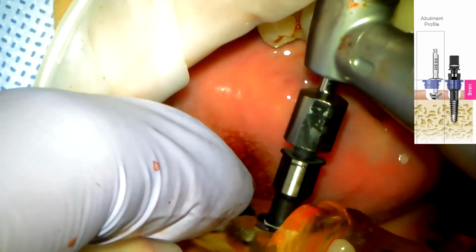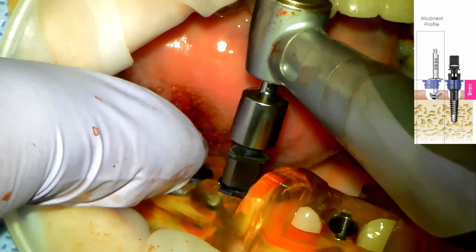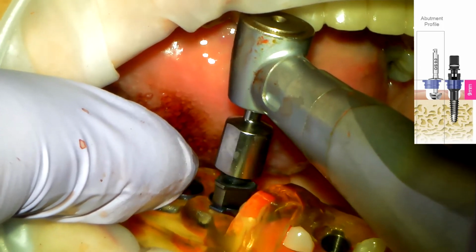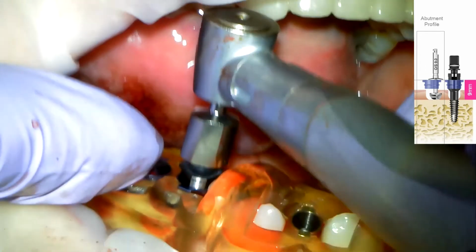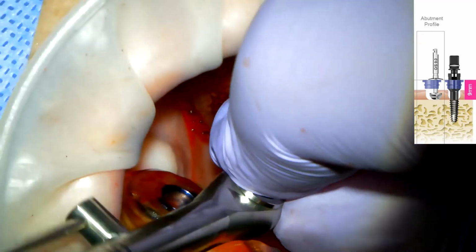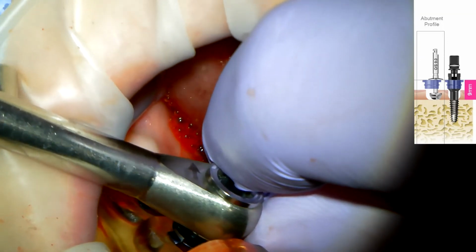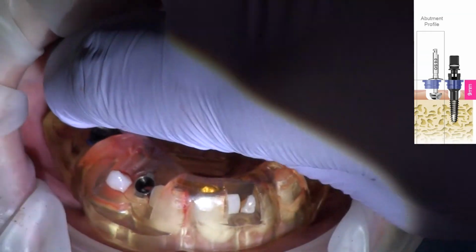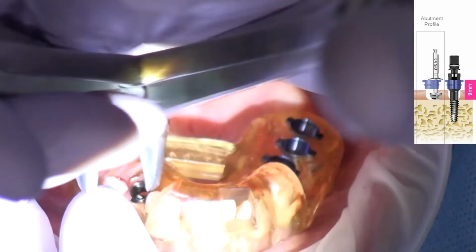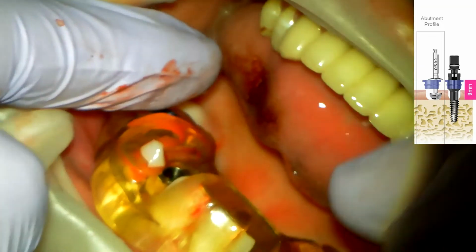My motor is at 30 RPMs, 35 torque. Just about there. Starting to bind up a little bit. I don't mind that. We're going to use a hand torque and do the rest. Not getting much tighter, so I feel perfectly fine advancing this. That looks beautiful. Right there, I lined it up even though it's not needed. I'm now going to use a rongeur, and I'm going to remove that. Real big. Little wiggle. There we go.